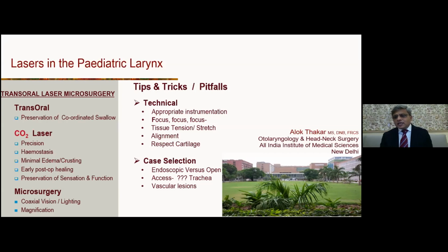And last but not least, if the child has an anterior web which is not giving airway obstruction, don't operate with laser. That's the take home message. If you use a laser for a thin anterior web in a young child, maybe 1 or 2 years of age, then it may land into a transglottic stenosis. So you have to be very careful using a laser in a child for indications which are not really giving quite a bit of airway obstruction.